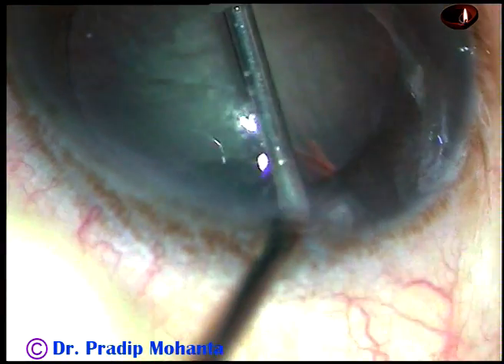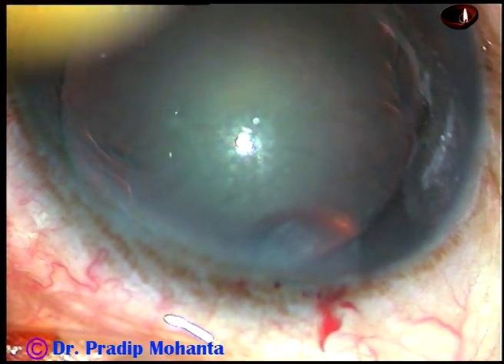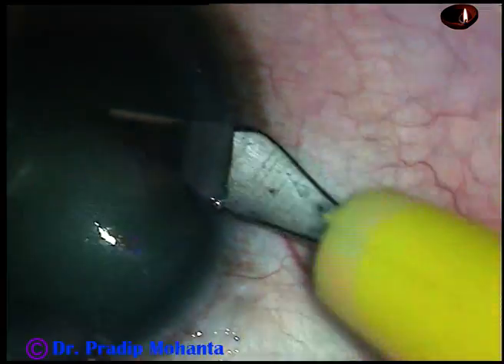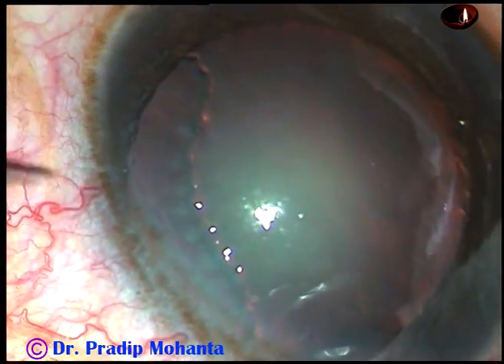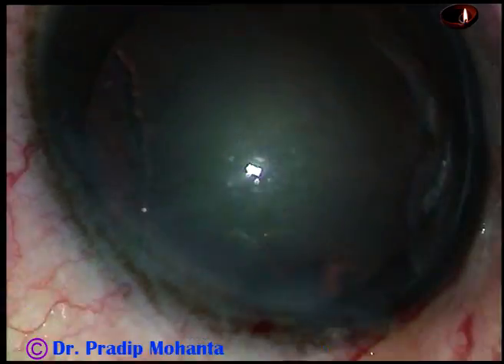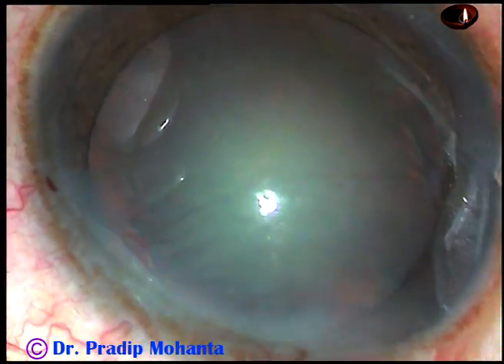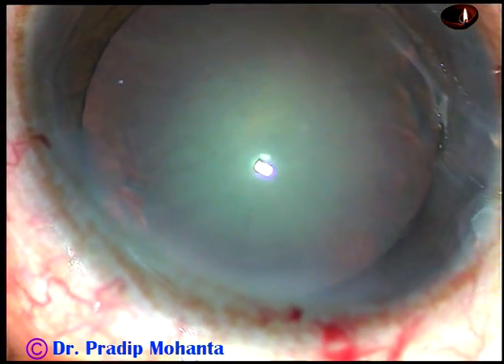By this time, the main incision has been made. Viscoelastic substance has been injected into the anterior chamber. And now this is a paracentesis on the right side of the main incision, and this is another paracentesis on the left side of the main incision. I usually make the side ports about 2 and a half to 3 clock hours away from the main incision.